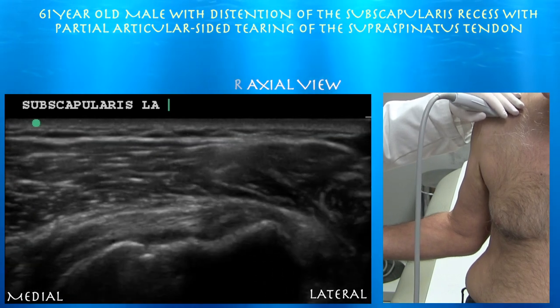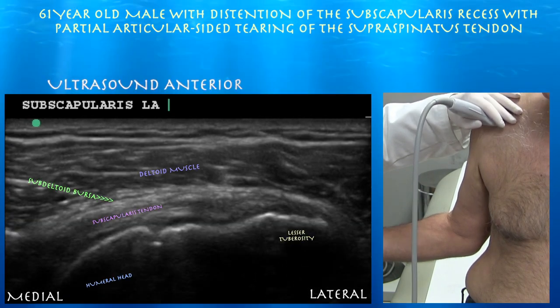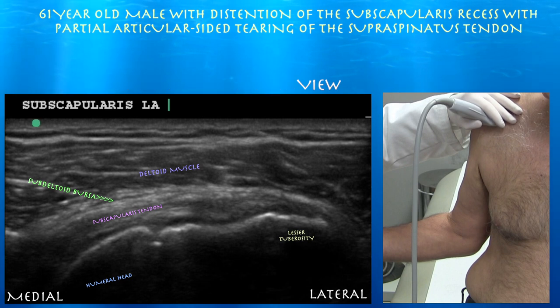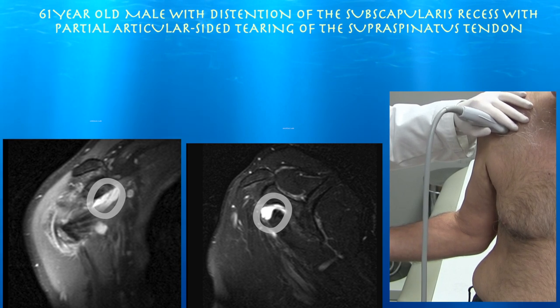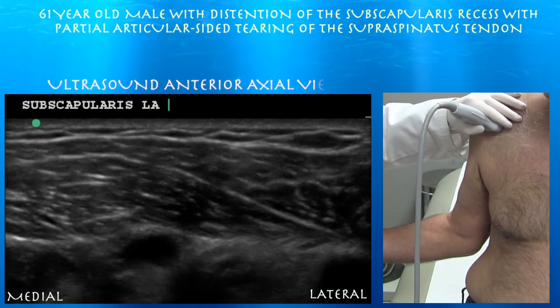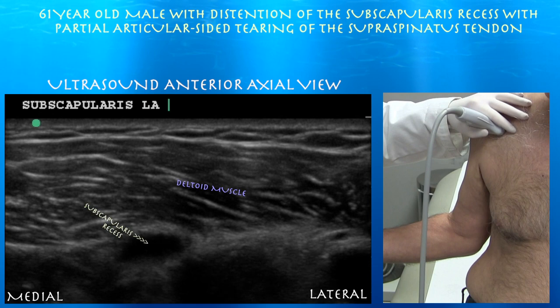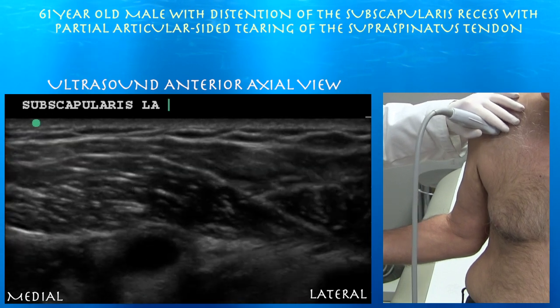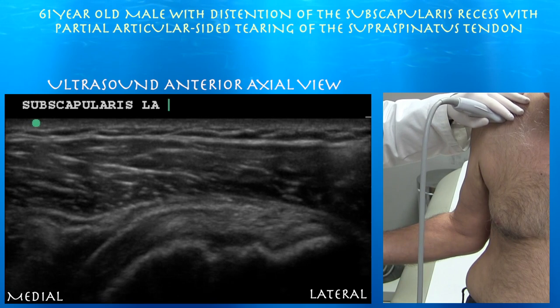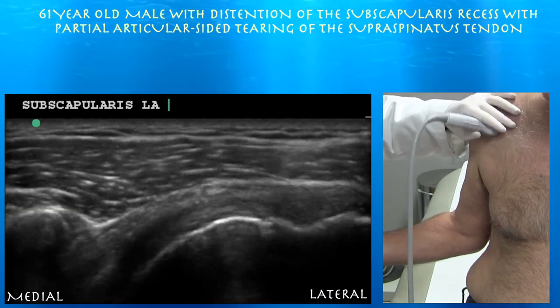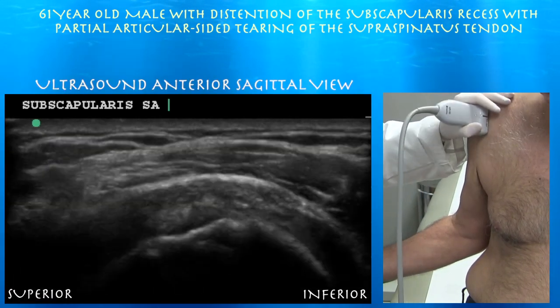The subscap tendon looks fairly okay. Here's a normal subdeltoid bursa which is not distended. The thing I wanted to mention is that he does have an overhanging subscap recess, which you can see here. We're in long axis to the subscapularis tendon and you can see part of this distended subscapularis recess above the subscap tendon, which overhangs — this is really fluid from the joint coming out. You don't want to confuse that with subdeltoid bursitis. Right side of the screen is inferior.